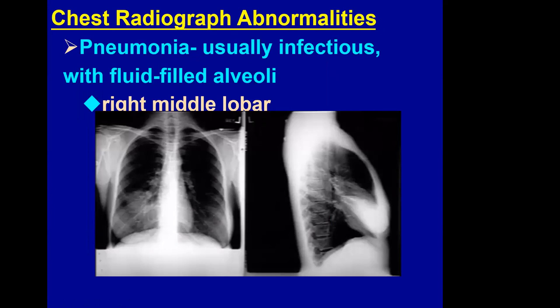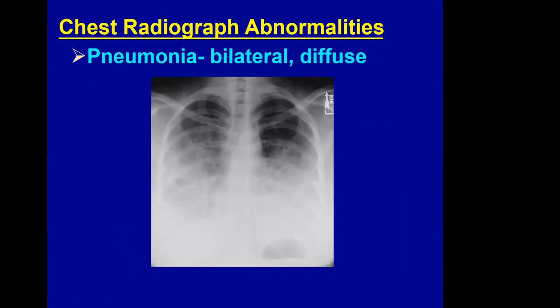Pneumonia on a radiograph is usually infectious with fluid-filled alveoli. This example is a right middle lobe pneumonia, seen first on what appears to be a PA film and then on the lateral view. The wedge shape of the right middle lobe is clearly seen. Pneumonia can also be bilateral and diffuse, as in this picture of a patient with severe bilateral pneumonia where the alveoli are filled with fluid.